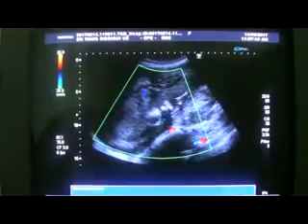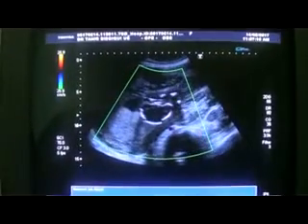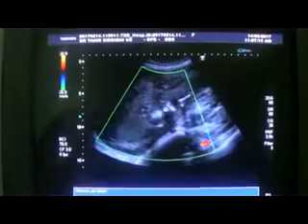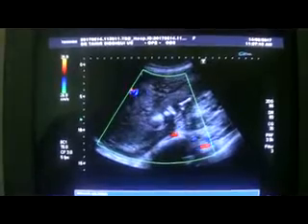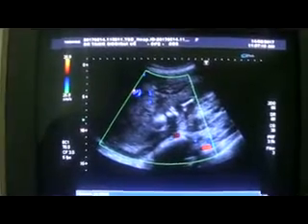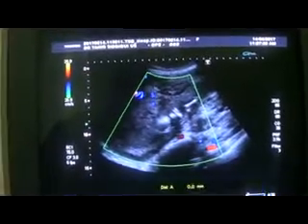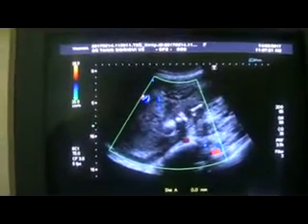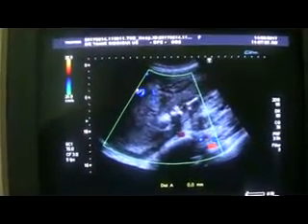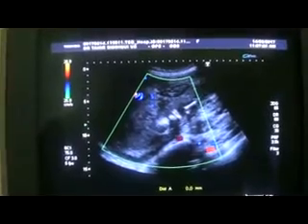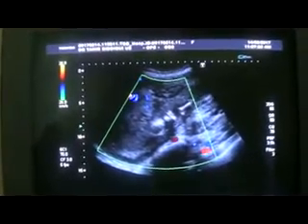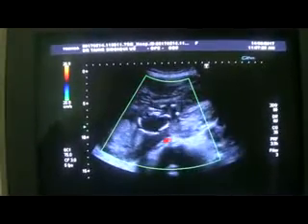This is a case of intrauterine fetal demise. This is the femur. Here at 20 weeks gestational age, and here you see the head of the fetus.